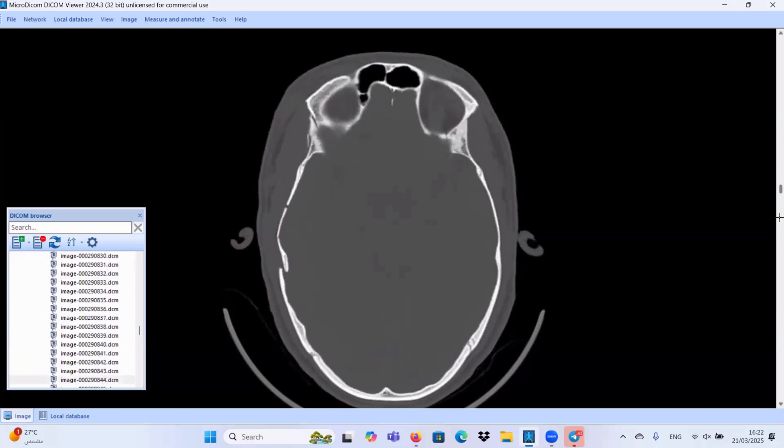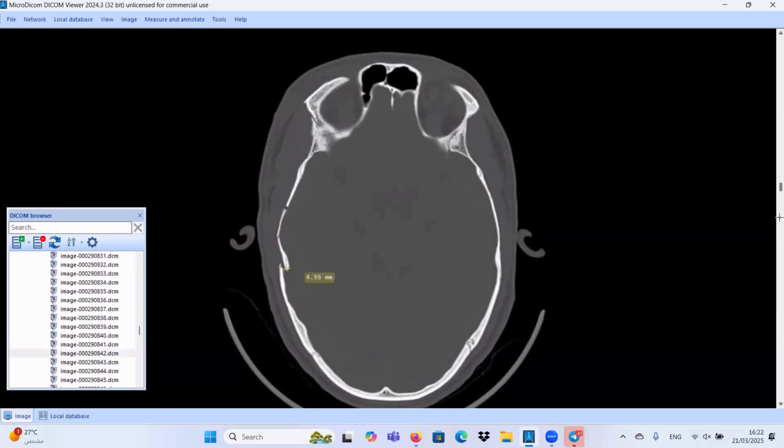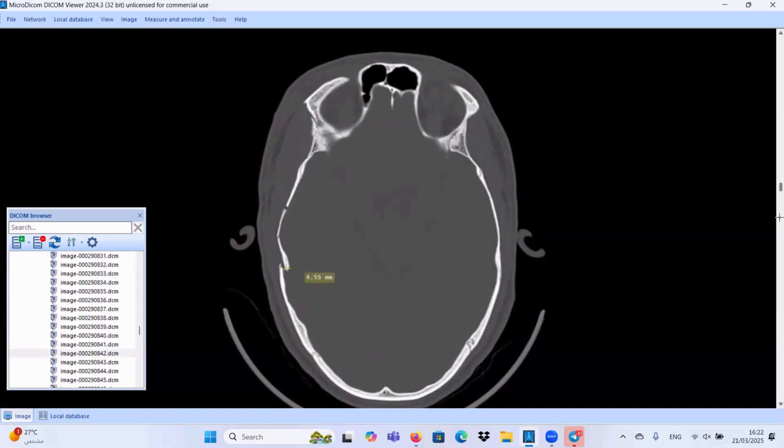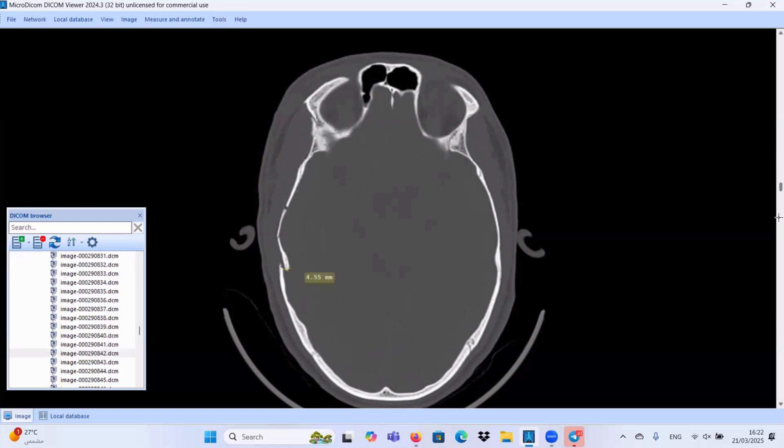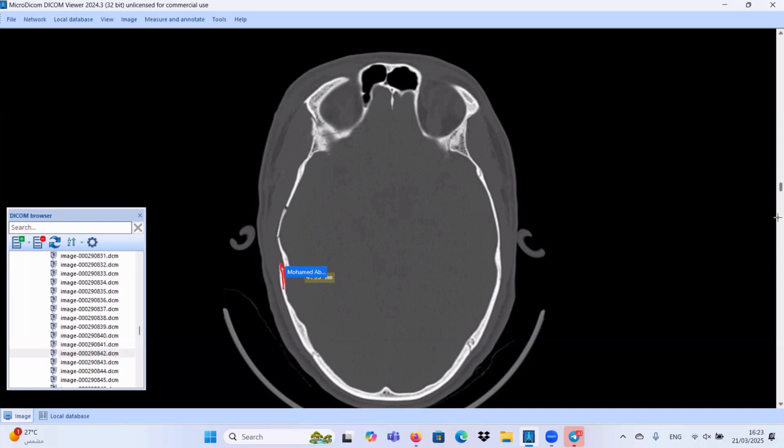Once we have any depressed fracture, you should comment on two points. First, is the depressed fracture greater than the calvarial bone thickness? Let us take red color. Is the depressed fracture bypassing this normal non-depressed calvarial bone? Yes, for sure. This depressed fracture is bypassing the whole thickness of the non-depressed calvarial bone.